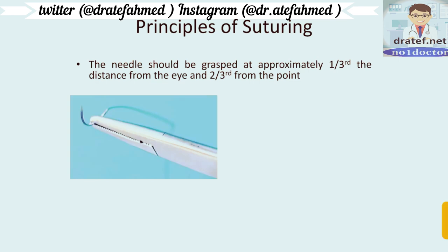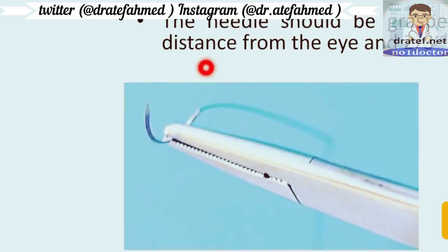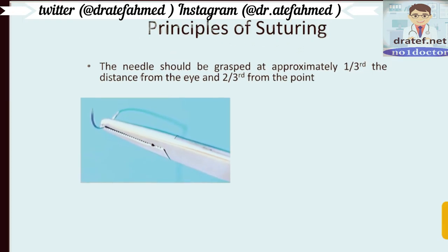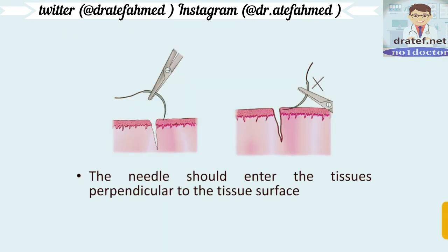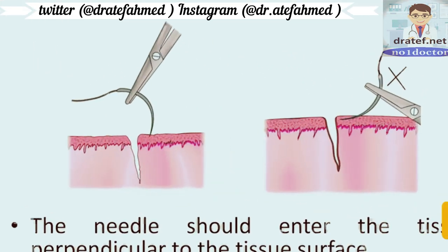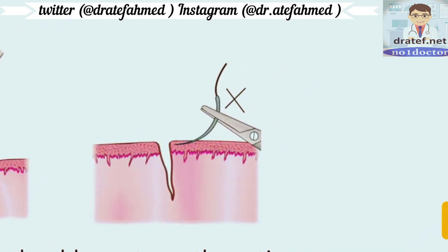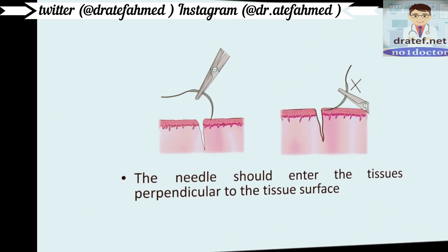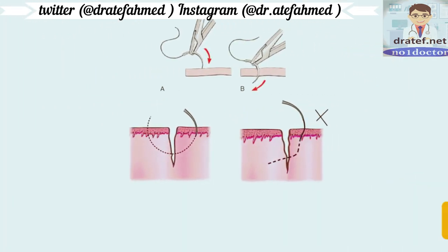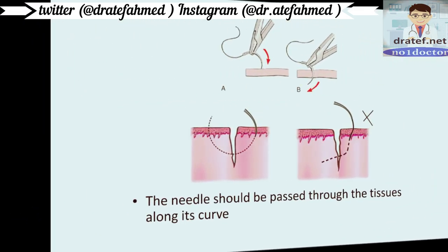The needle should be grasped at approximately one-third of the distance from the eye and two-thirds from the point — this is the correct position to hold the needle. The needle should enter the tissue perpendicular to the tissue surface, at exactly 90 degrees. This is the correct way, rather than at a very shallow angle.